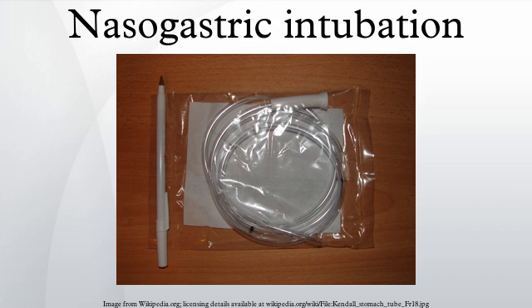The end of a plastic tube is lubricated and inserted into one of the patient's anterior nares. The tube should be directed straight towards the back of the patient as it moves through the nasal cavity and down into the throat. When the tube enters the oropharynx and glides down the posterior pharyngeal wall, the patient may gag. In this situation the patient, if awake and alert, is asked to mimic swallowing or is given some water to sip through a straw, and the tube continues to be inserted as the patient swallows. Once the tube is past the pharynx and enters the esophagus, it is easily inserted down into the stomach.